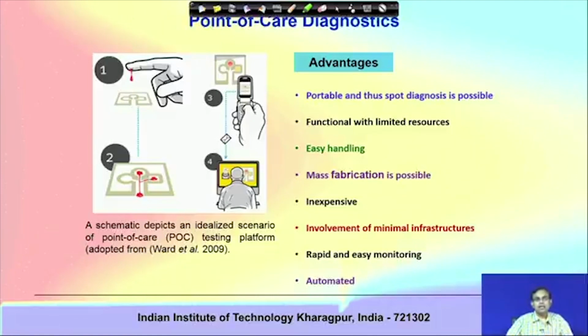So, at these 3 different sites 3 different chemicals are there, and the blood, by reaching these places, may change its color, and sometimes the color change is visible. That means you can understand something about the signal by looking at the change in color, but in most cases we need more quantitative information. So, the image of the change in color needs to be grabbed and processed.